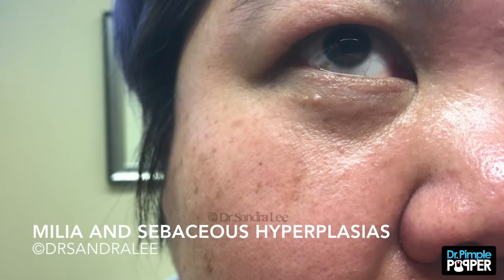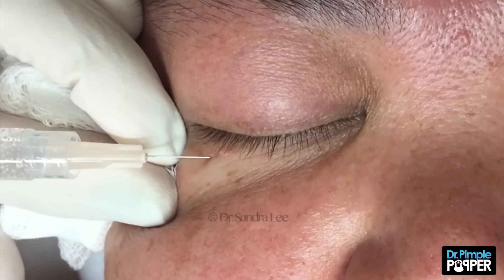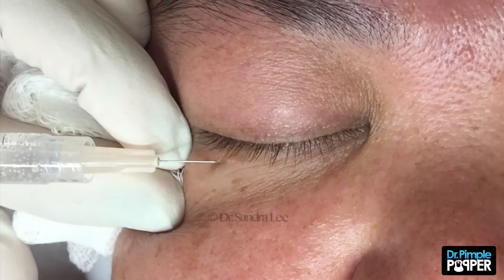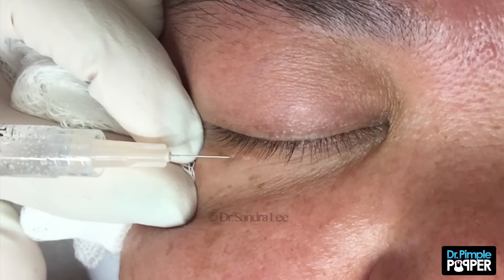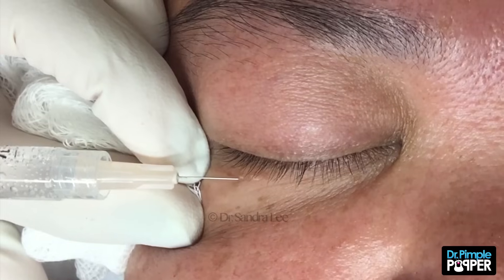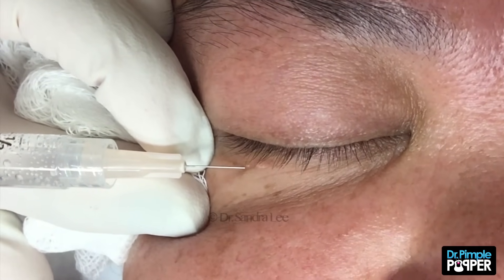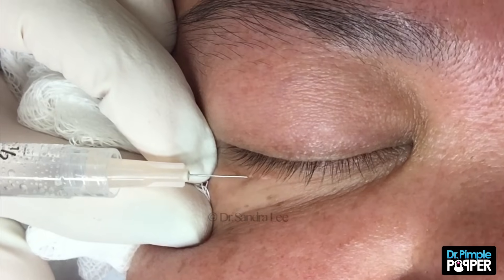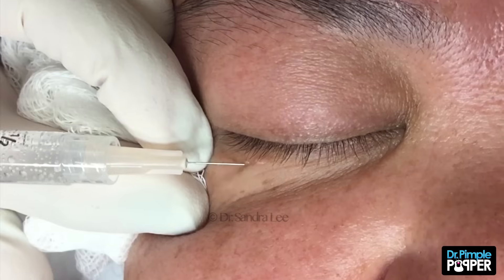Can you do it? Good. Sometimes, just really superficial, I can bruise a little bit. We're just gonna sit and you're gonna take nice deep breaths — because if you stop breathing, I've got a lot of paperwork I gotta fill out. We'll do that. Just gonna sit here and go nice and slow. Make sure you're nice and numb.